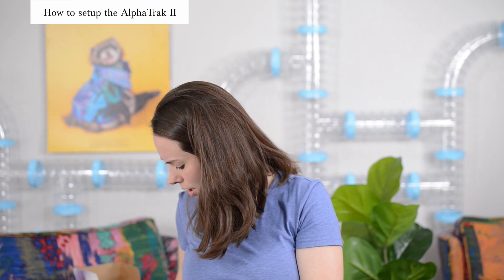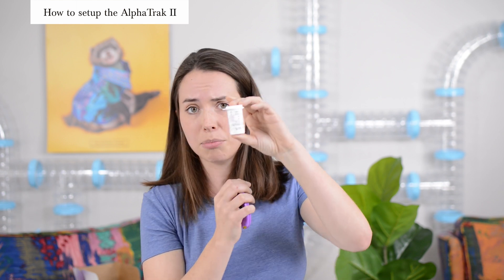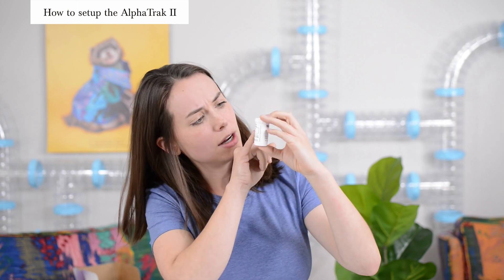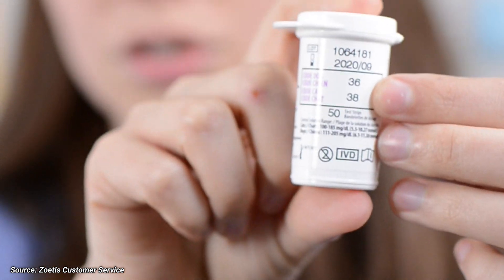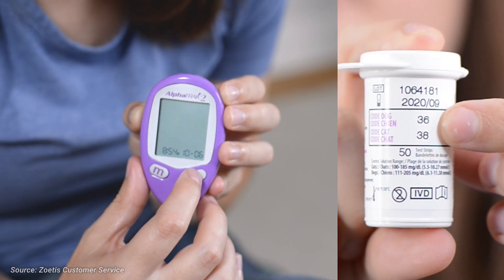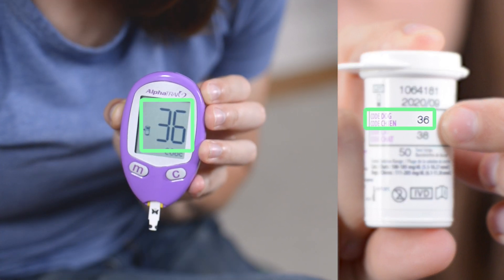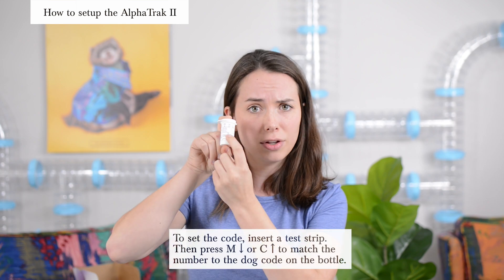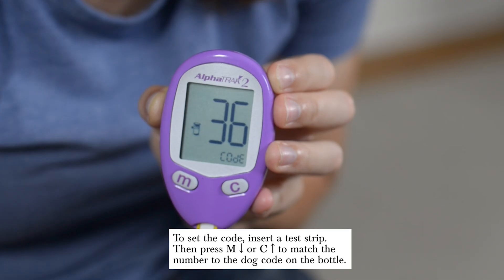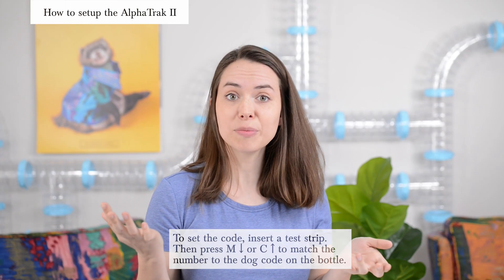Before you test your ferret's blood glucose for the first time, make sure you're using the correct code for ferrets. On the bottle of testing strips there's a dog code and a cat code — the dog code is the one you want. For ours the dog code says 36, but different bottles may have a different number. Always follow the code of the test strips that you're using. Once you have that set, it's reading everything correctly and you're good to go.